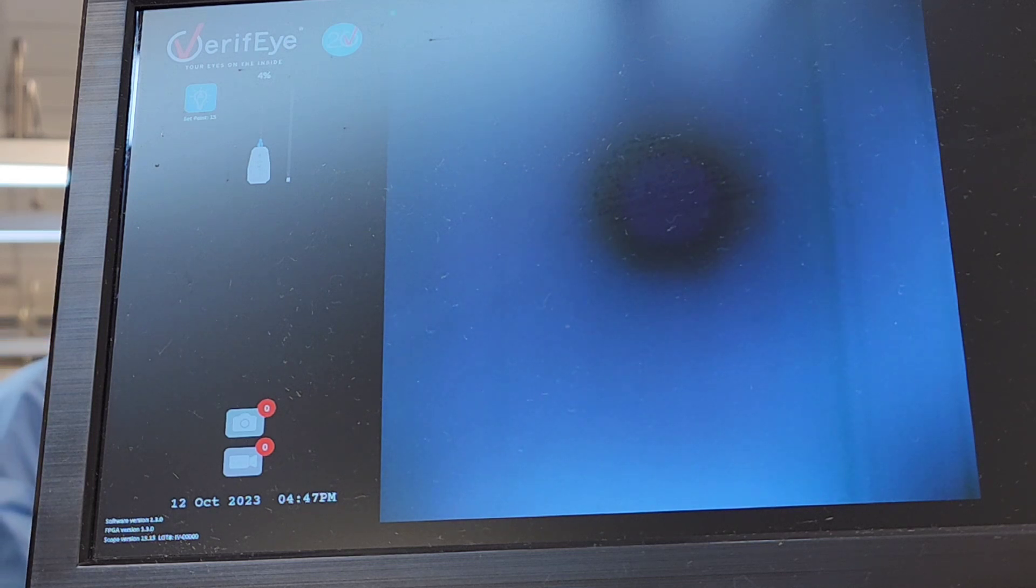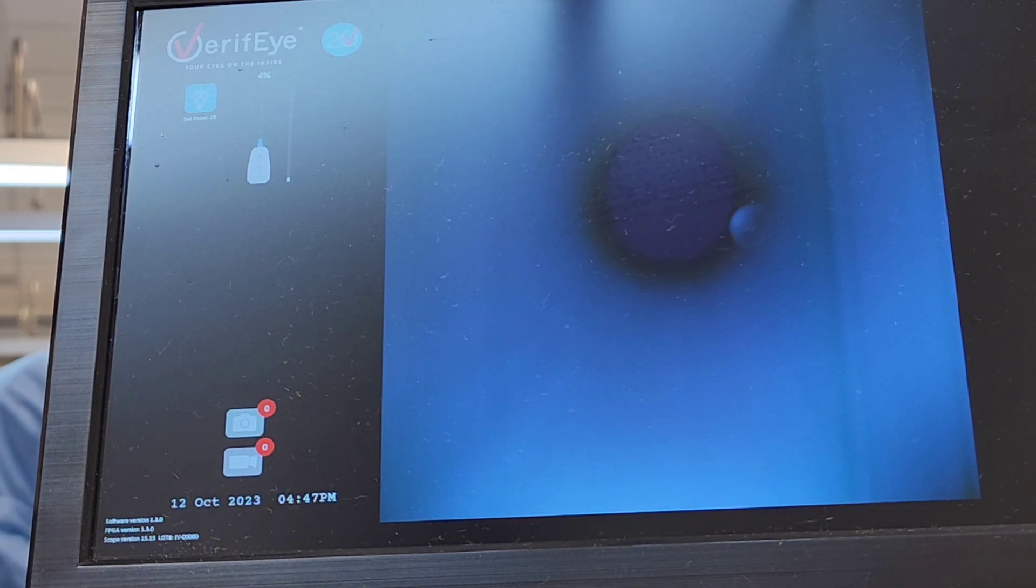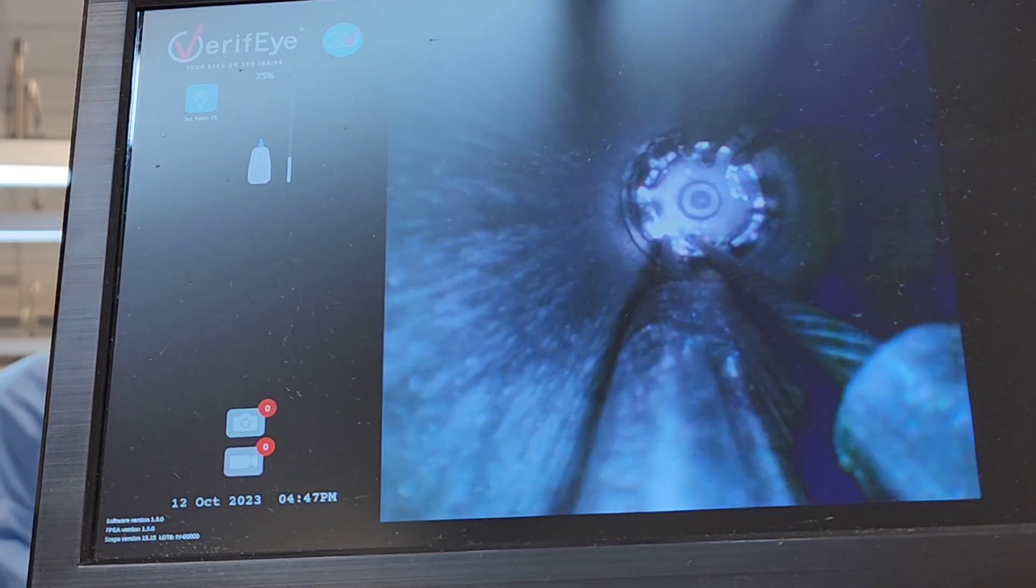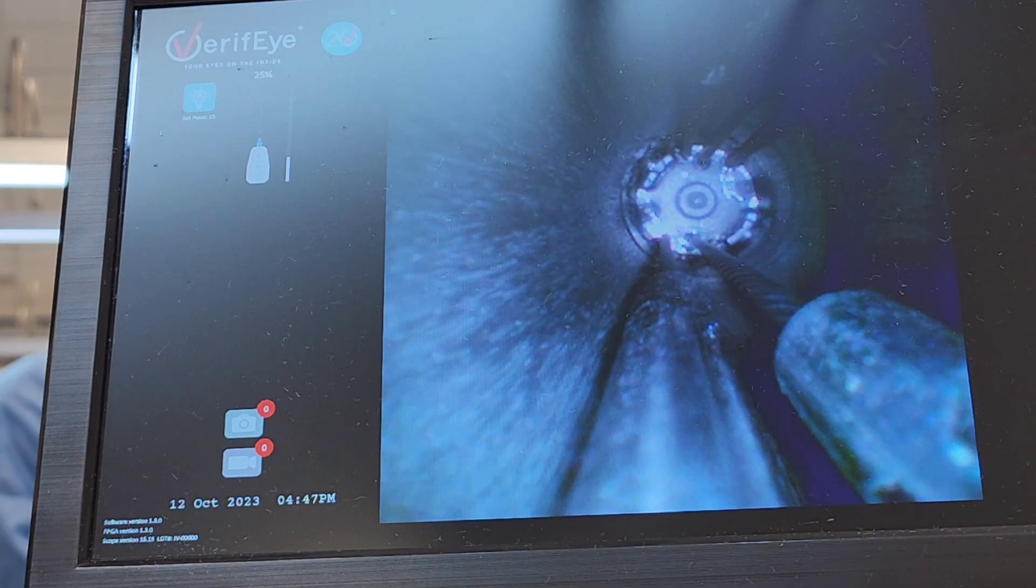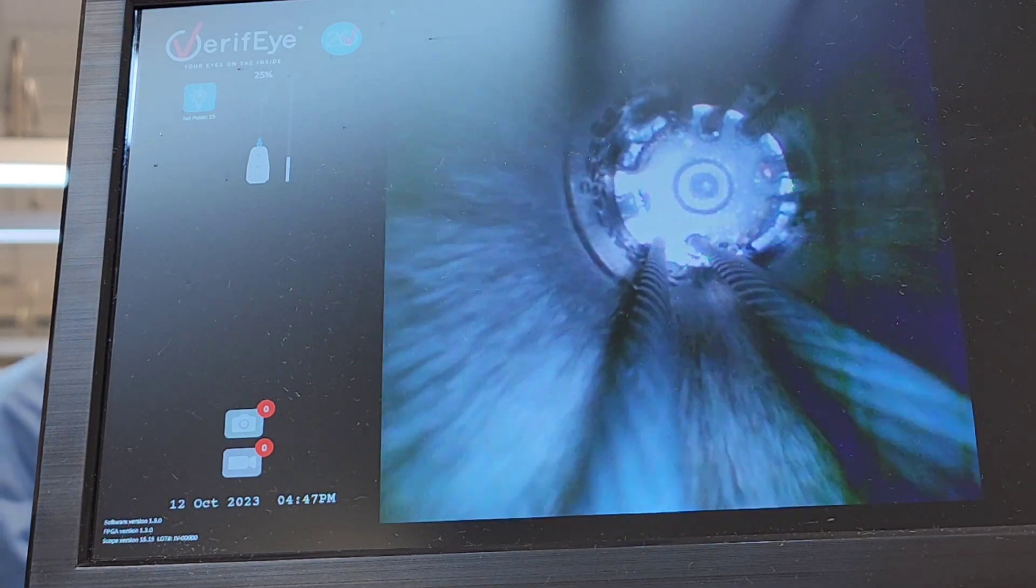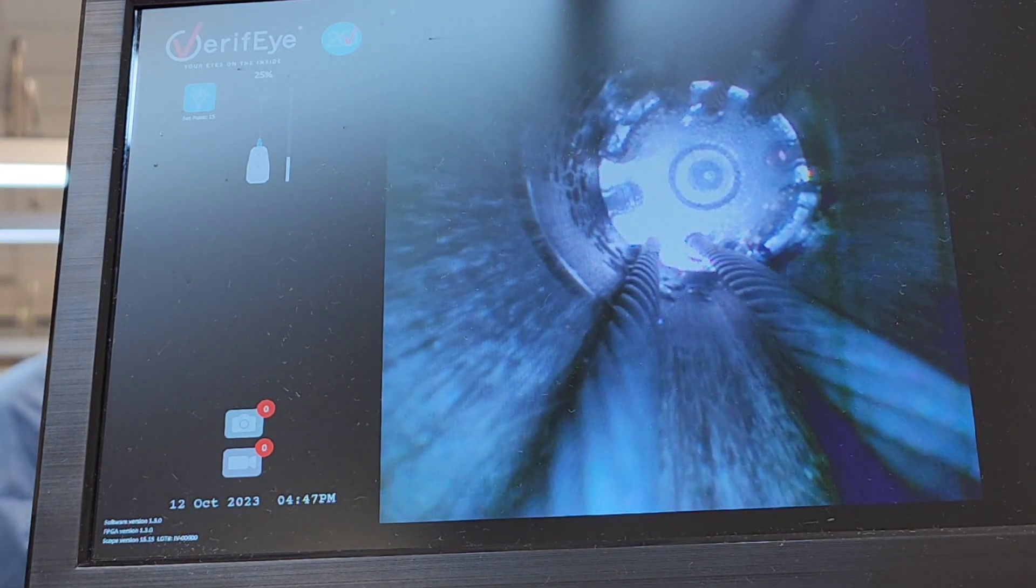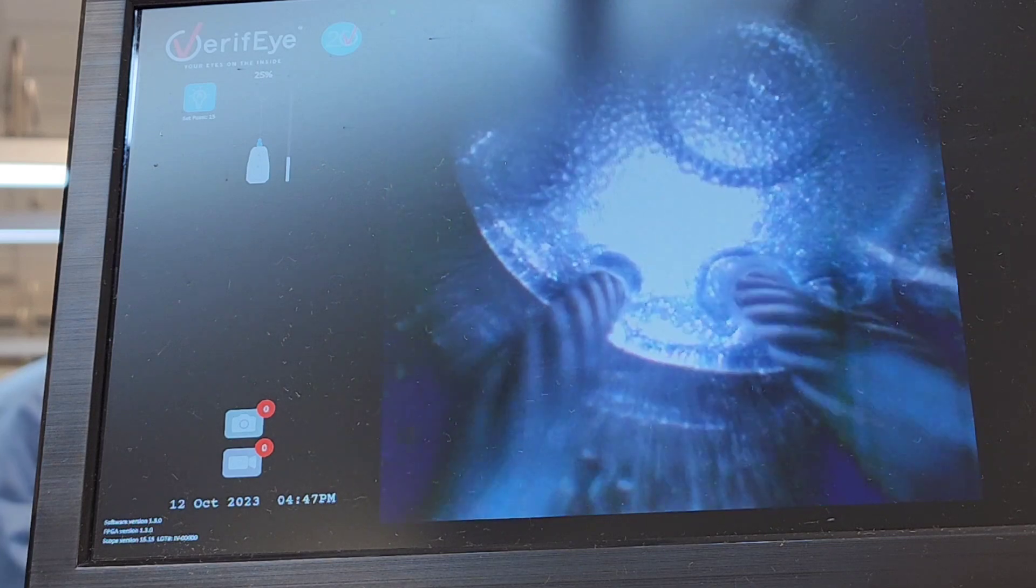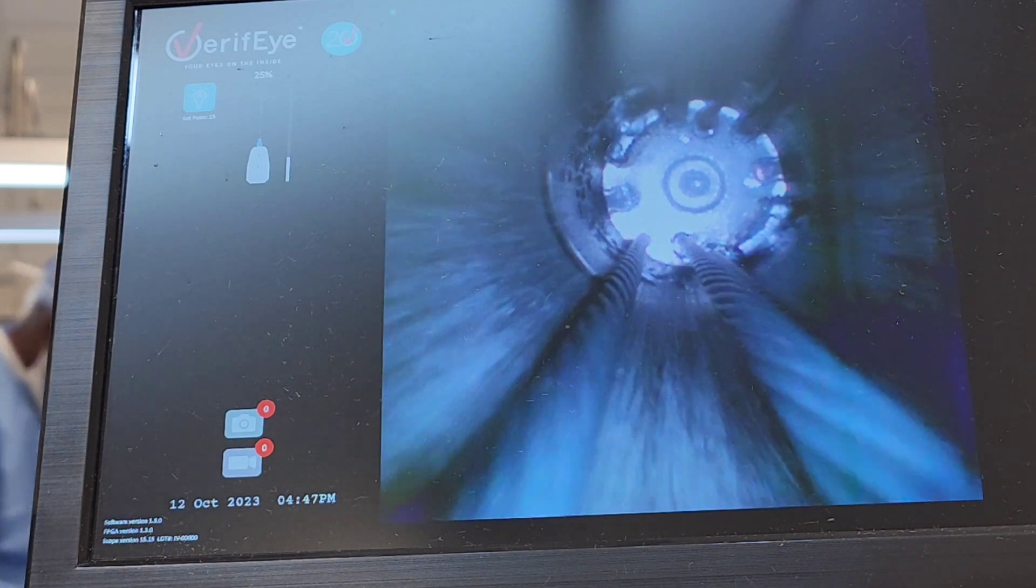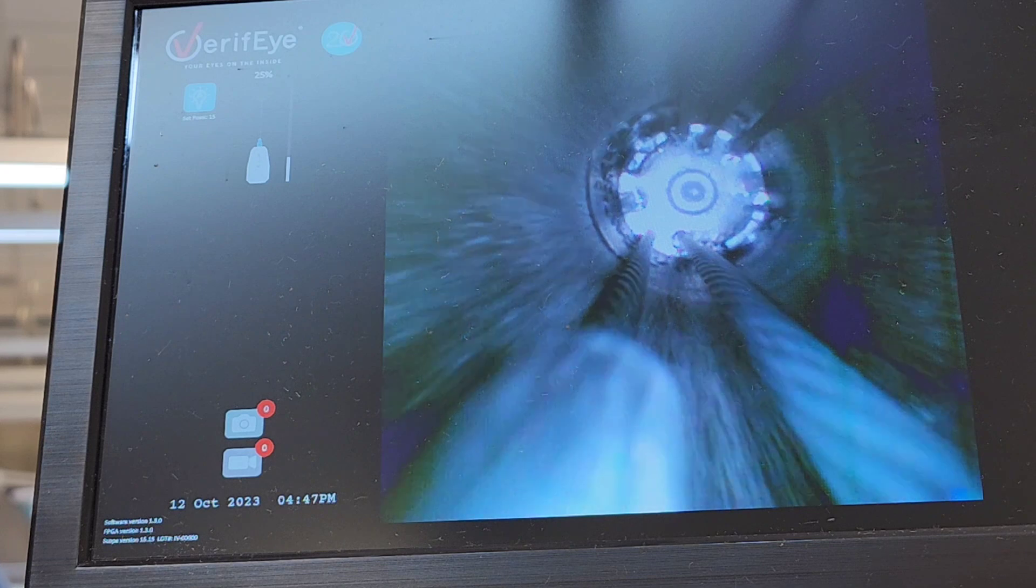I might have to adjust my boroscope some to bring it down some so I can catch the whole length of the device. Here is the distal tip where the actual pulley cords are at, the wires. You want to make sure nothing's fraying, that there's no debris in there.